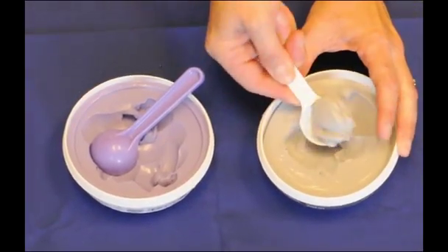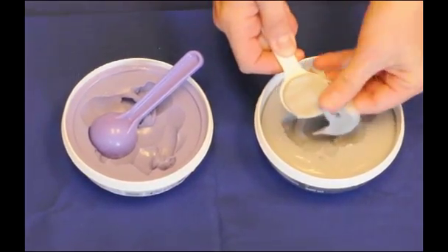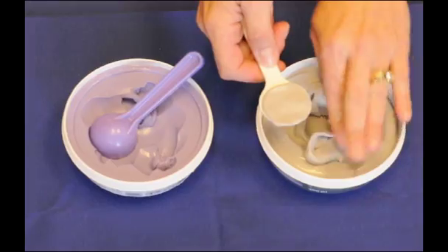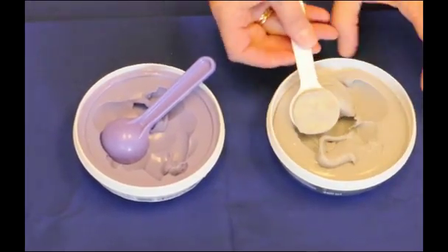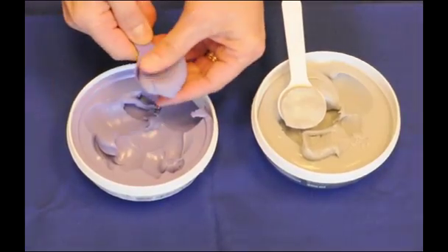I'm using Flexi-Time Putty by Horreus, and you'll notice that I'm getting out a very level scoop. I want to make sure that we use even amounts of base and catalyst, as the materials, handling properties, and set time are all dependent upon having these equal quantities.